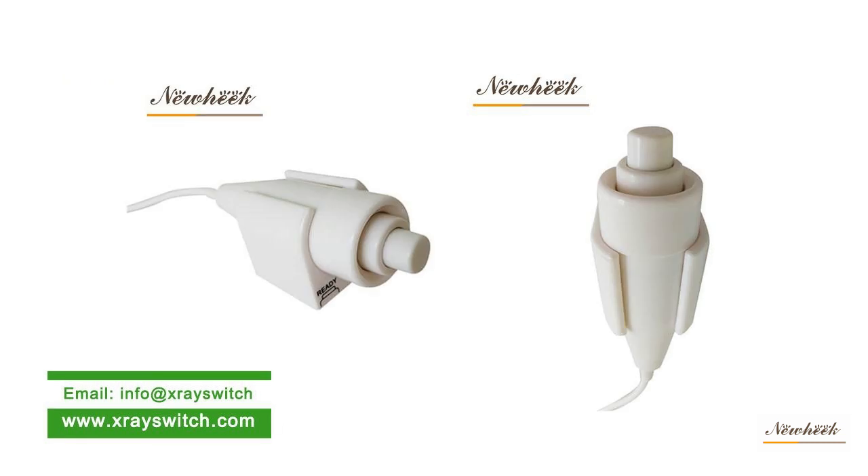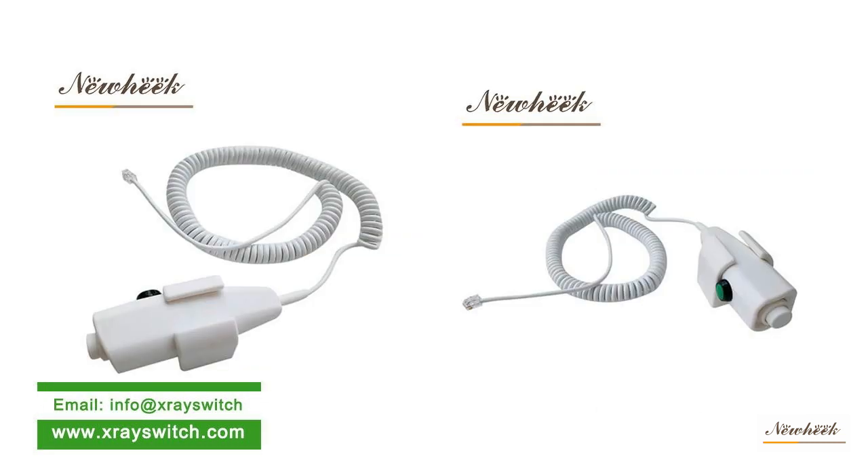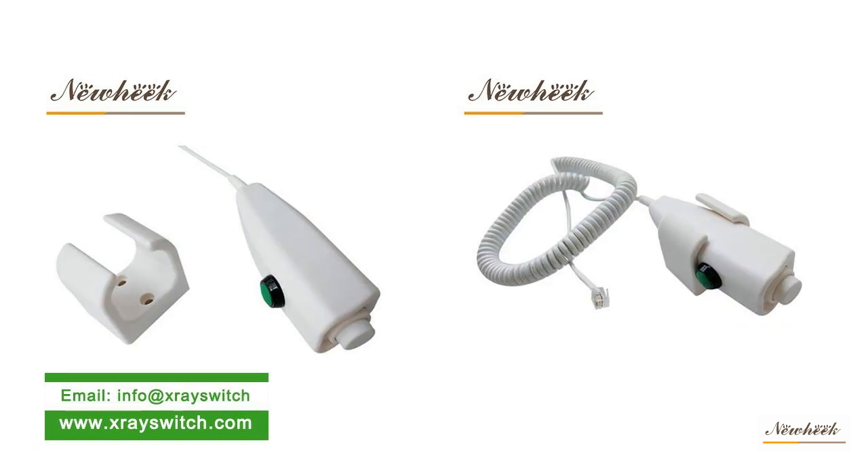Introduction to the wired X-ray hand switch: this handbrake uses an Omron micro switch. The service life improves six times. The performance is stable, feel more comfortable and durable.